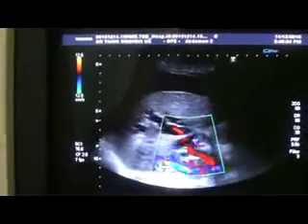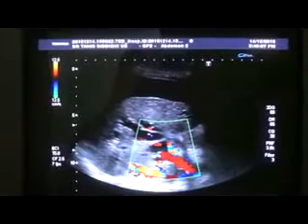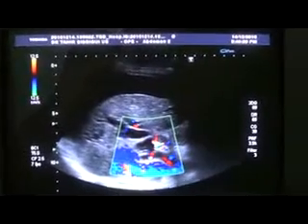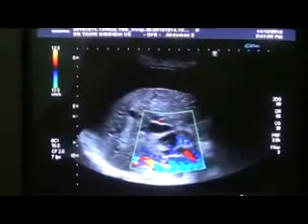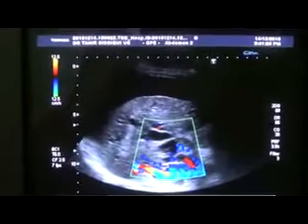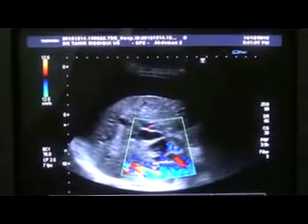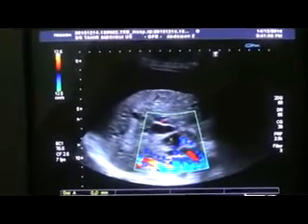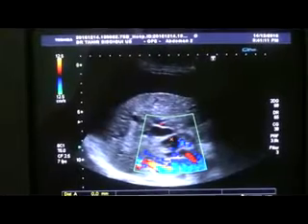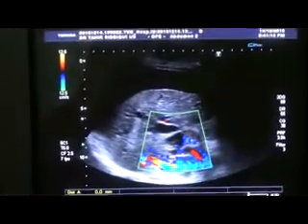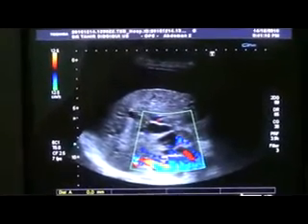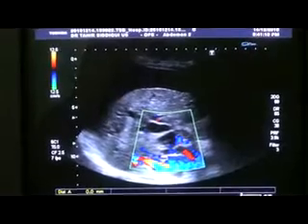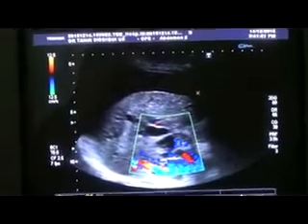This is the IVC, this is the portal vein, this is the dilated common bile duct, and you can see there is thick sludge within it. These are the dilated intrahepatic bile ducts, the cirrhotic liver, and the ascites in this view.